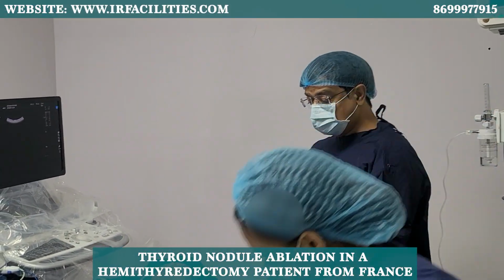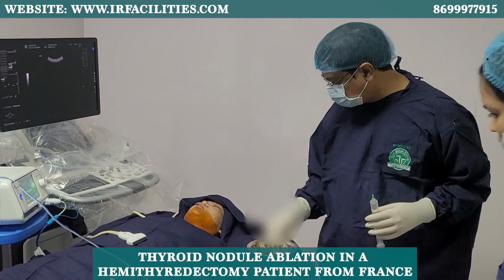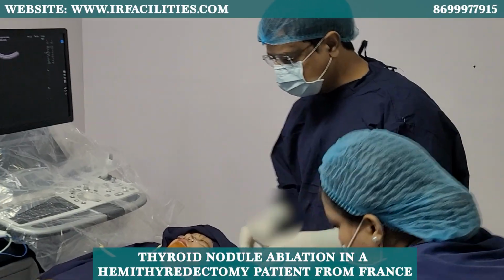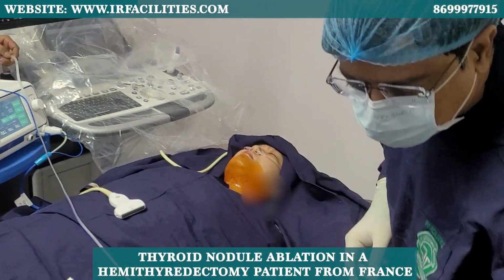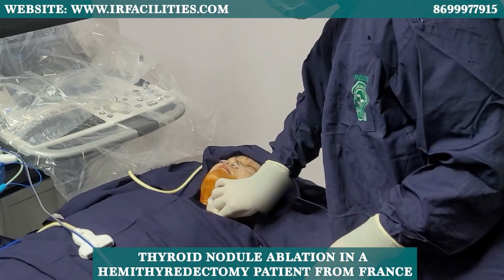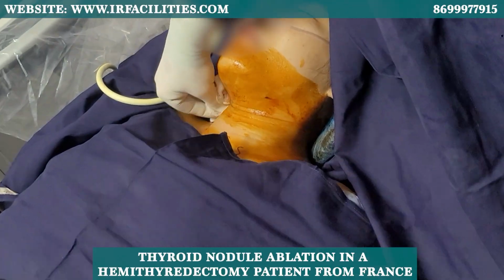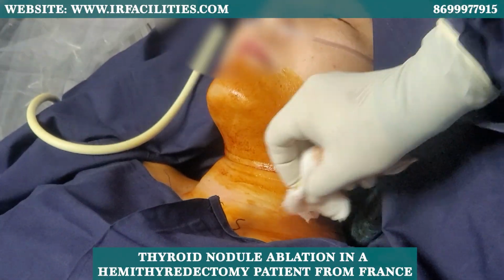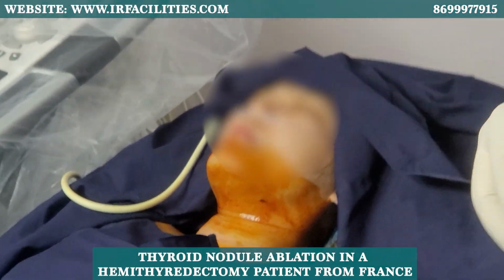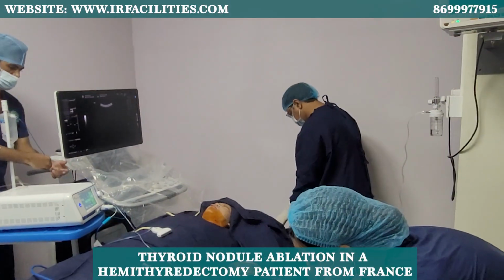Now this is a patient who's undergone hemithyroidectomy. So you see the problem of hemithyroidectomy. What I'll do is I'll show you a big scar on her neck. So this is a big scar, you see, this is a scar here. So she's got a big hemithyroidectomy in Manipur. Half of her thyroid has been removed, and we're going to ablate the lesions in the other half of thyroid.